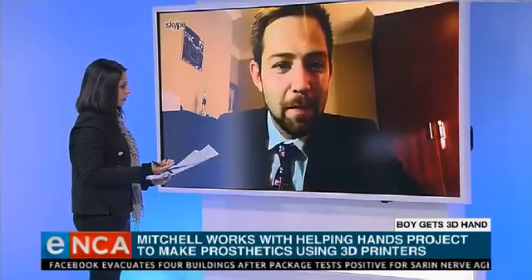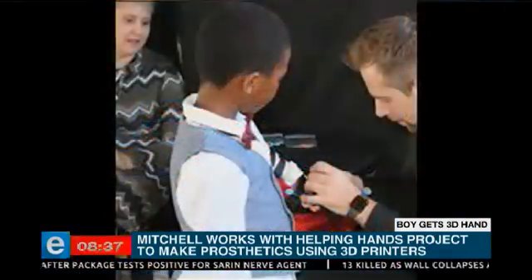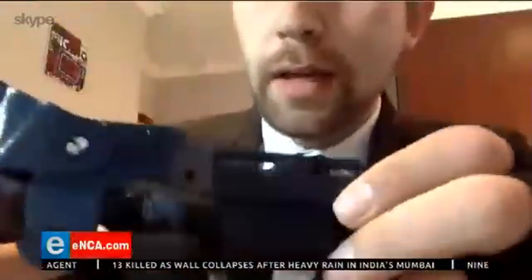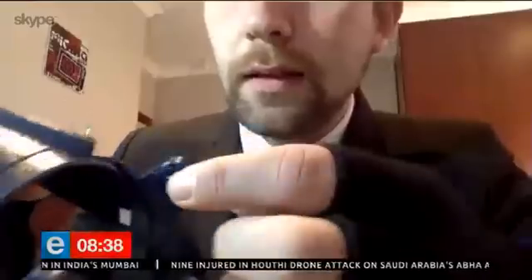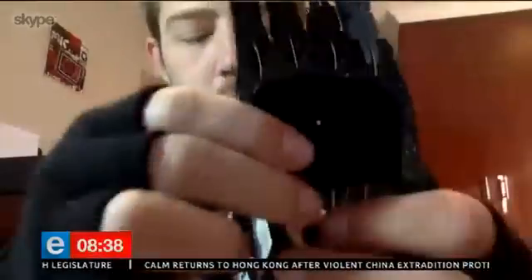Is this hand merely aesthetic or is it actually fully functional? It is fully functional. Through the elbow — I've got one of the new prototypes here — a line runs through this point over here, and then where the elbow actually bends it goes down this pipe. It goes with fishing lines through the hand all the way down the fingers. Basically, when the strings tighten, the fingers close.